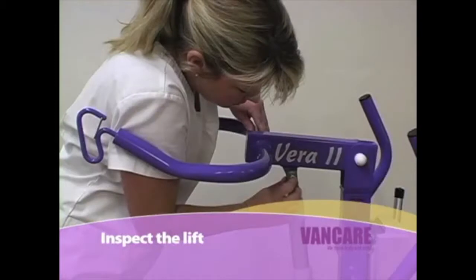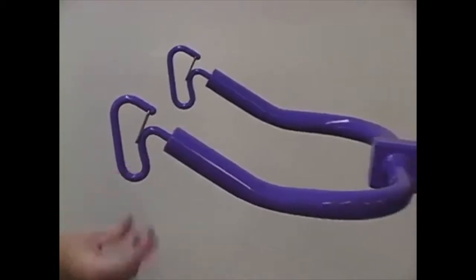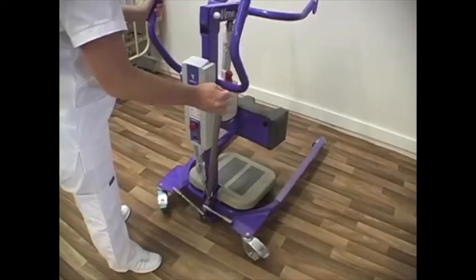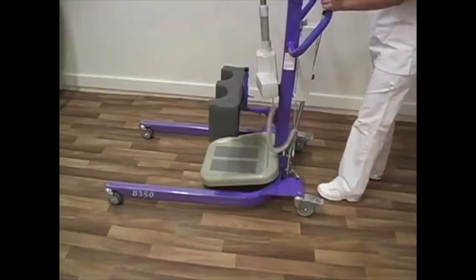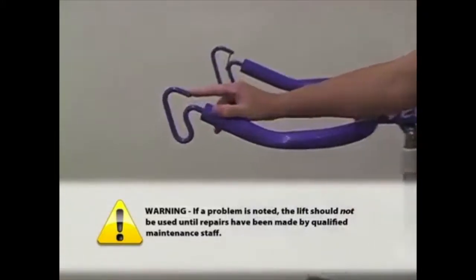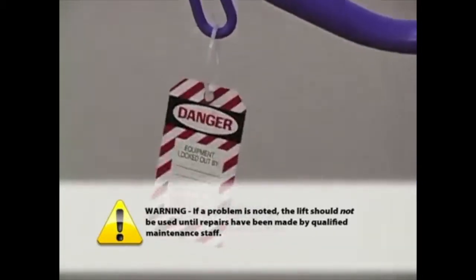Inspect the lift. It is also important to inspect the lift before transferring a client to make certain no parts are missing or excessively worn and that the lift operates freely. Make sure all nuts and bolts are present, that the lift arm hooks are not worn, that the shift bar opens and closes the base of the lift properly, the casters move freely, and the brakes hold the lift securely. Warning: If a problem is noted, the lift should not be used until repairs have been made by qualified maintenance staff.